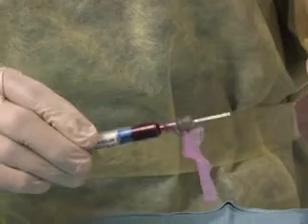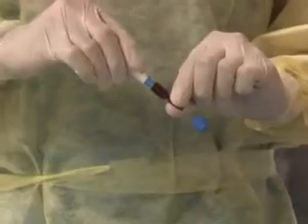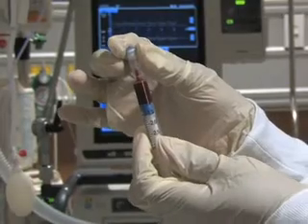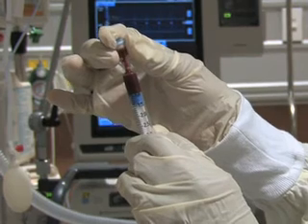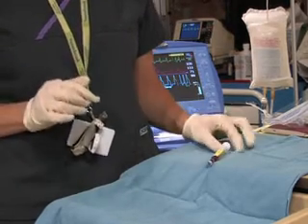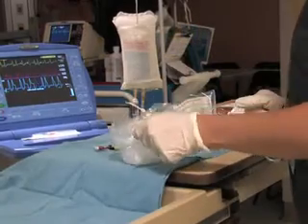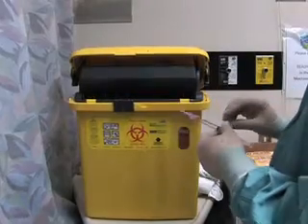In the meantime, expel the air bubbles from the syringe. Cover the needle with the attached safety cap and remove the needle from the syringe, or remove the needle using the rubber stopper. Attach the heparin-containing cap and, while holding the cap in place, push the plunger of the syringe to ensure the blood encounters the heparin — this will prevent the blood from clotting. Ensure that the syringe is labelled with the patient's name and unit number. Place the entire syringe in the bag of ice if transport to the lab is required. After pressure has been applied to the puncture site for 5 minutes, affix the gauze with some tape. Dispose of all sharps in the designated sharps containers.